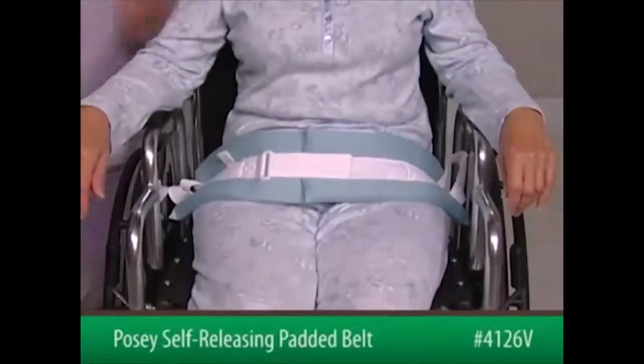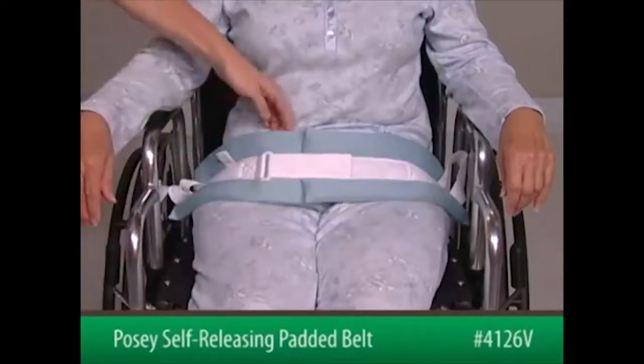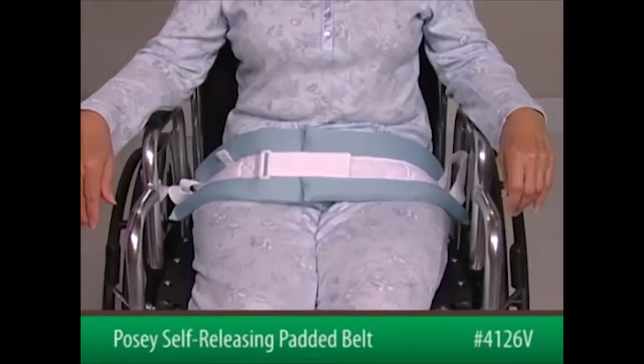After connecting the straps to the back of the wheelchair, slide an open hand, flat, between the device and the patient to ensure proper fit. The device must be snug but not interfere with breathing.